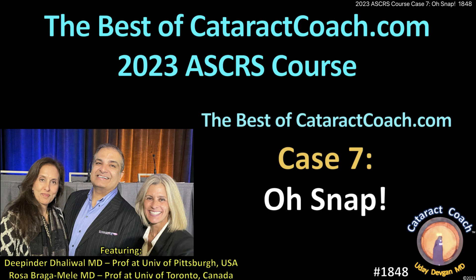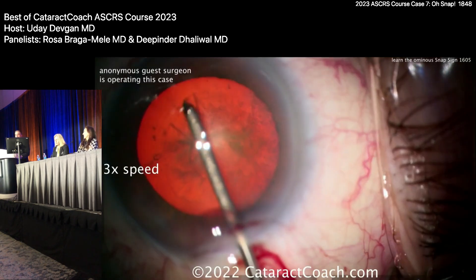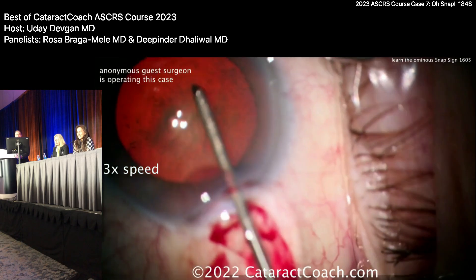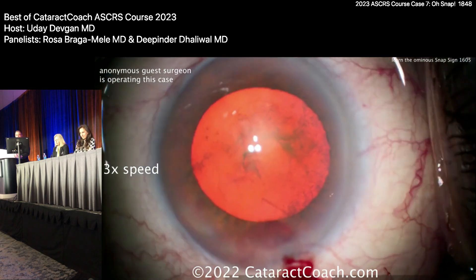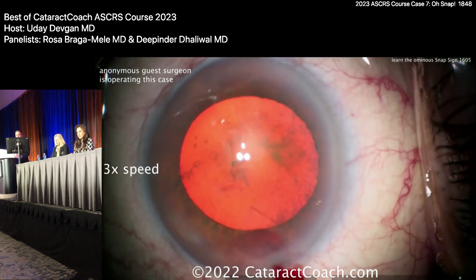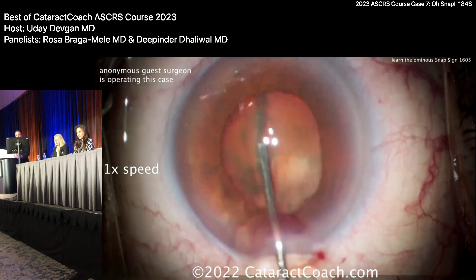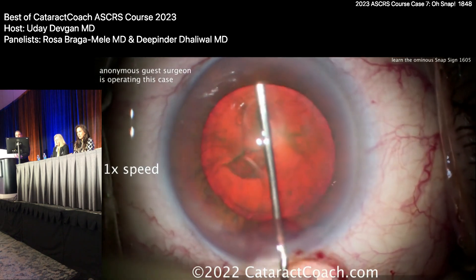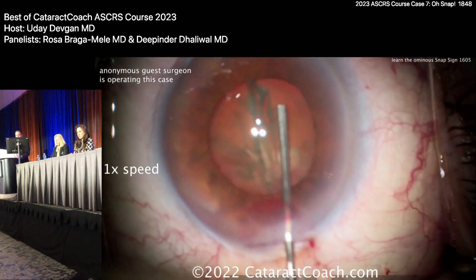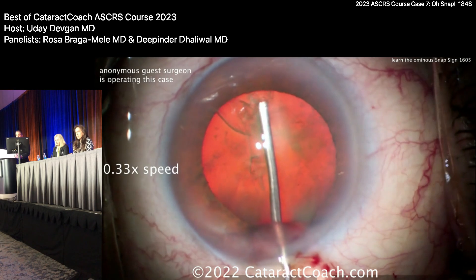From cataractcoach.com, more from our ASCRS course. This is an important one — I'm going to show you in slow motion. This is called the 'Oh Snap' sign, submitted by an anonymous guest surgeon. It's a nice-looking capsulorhexis video, sped up a little. Watch carefully — learning the ominous snap sign. There's the hydrodissection cannula. Watch carefully. Let's watch it again at regular speed. Commit this to your brain — at one-third speed, let me show you again.